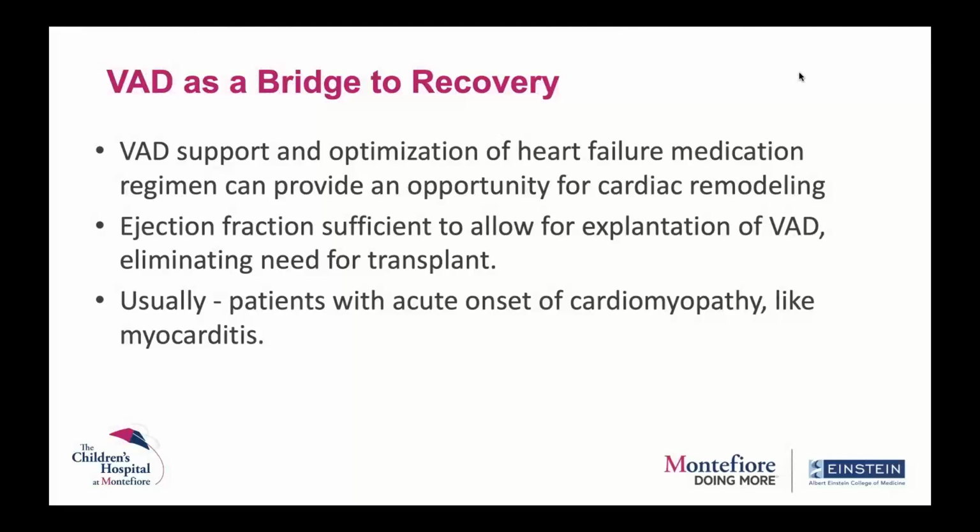And so we use VAD support and optimize their heart failure medication regimen to give an opportunity for the heart to remodel and recover. And we want the ejection fraction, or the percentage of the blood that goes out of the heart, enough or sufficient to allow for explantation of a ventricular assist device, thus eliminating any need for a transplant. Usually patients with acute onset of cardiomyopathy like myocarditis fall into this category where we sometimes implant ventricular assist devices as a bridge to recovery.